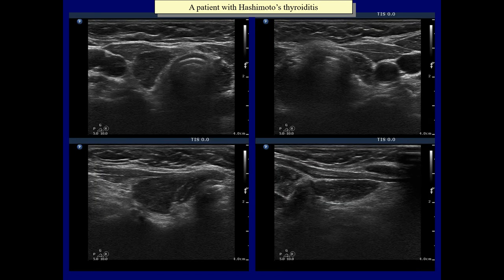therefore aspiration cytology is mandatory. Both lobes are composed of a central hypoechoic part surrounded with an isoechoic rim. The latter may be intact areas of the thyroid, but it seems more likely that the isoechoic field is connective tissue outside the thyroid. Note the shape of the hypoechoic part, which is not regular or geometrical. This is a characteristic pattern of Hashimoto's thyroiditis and is not infrequently interpreted as a large hypoechoic nodule surrounded with isoechoic part of the thyroid.